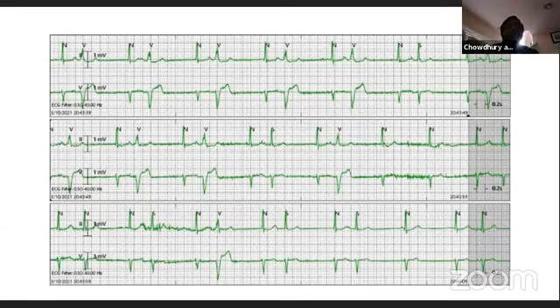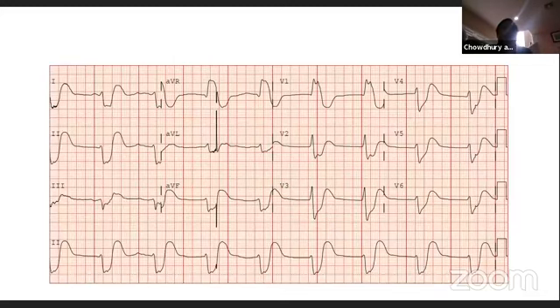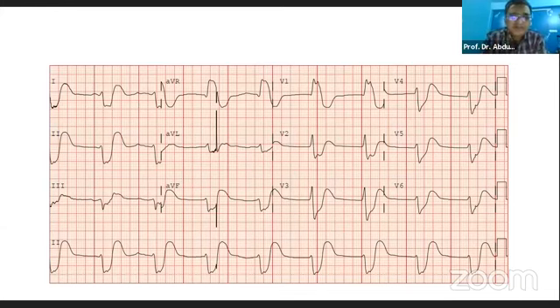That is another problem we sometimes have. So this is the EKG of another patient. What do you think about this? I did not give any history because I did not have any history. I saw this EKG in the morning when I was looking at the overnight EKGs, and I asked, what level of potassium?